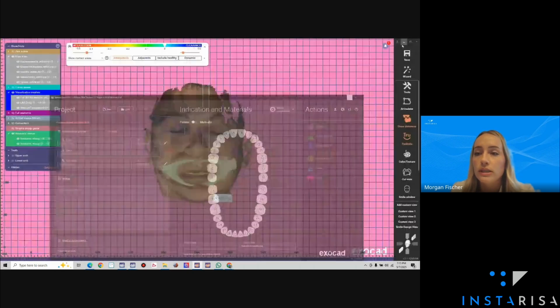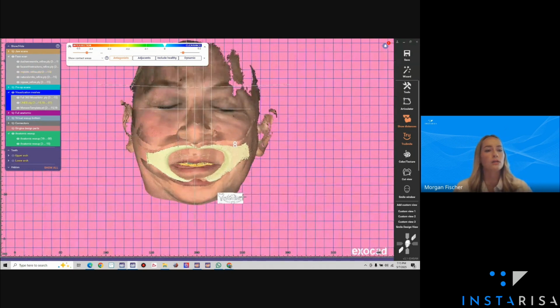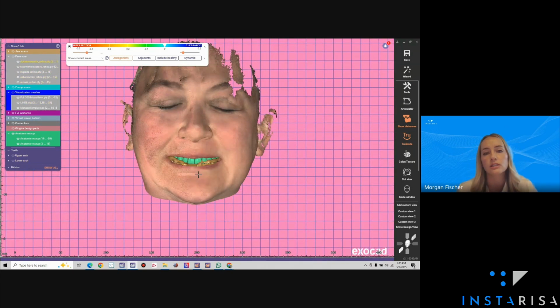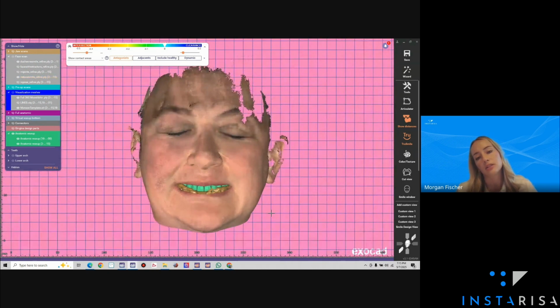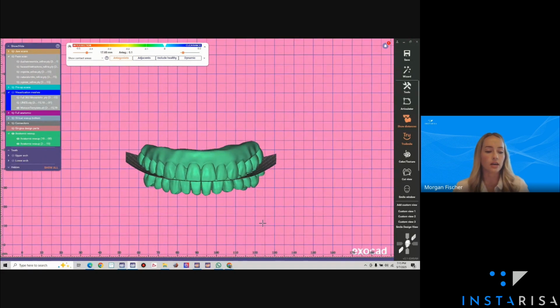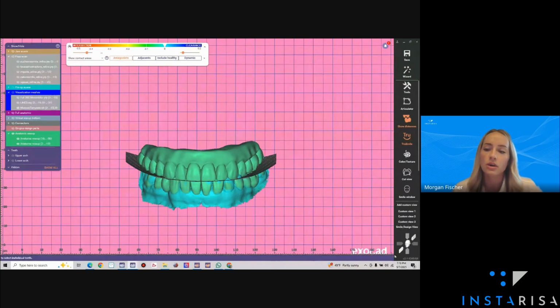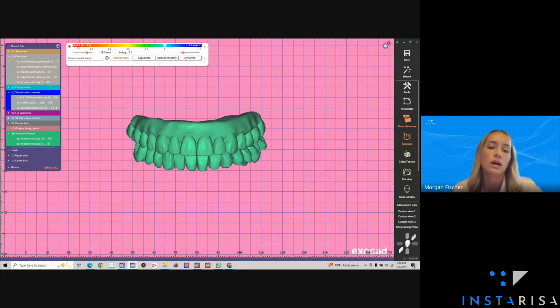So overall, especially in all-on-X patients that have collapsed verticals, to be able to set the bite with your extraoral scanner is a huge win for us, and I'll show a little bit of what that will look like. So just to start off with this patient here, this is just a pre-design that I did today, actually. The doctor originally planned for upper lower all on 4, and then due to the patient's age, we discussed back and forth. He decided that he wanted to proceed with crown and bridge on the lower arch. So I'm just going to flip through my meshes here.